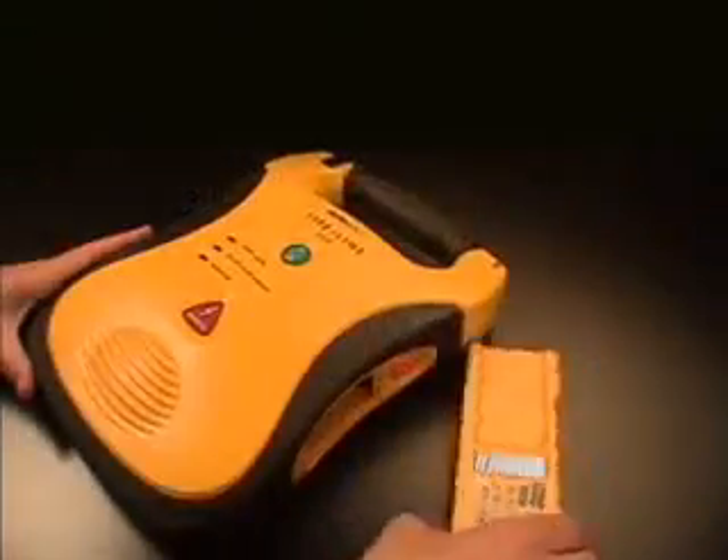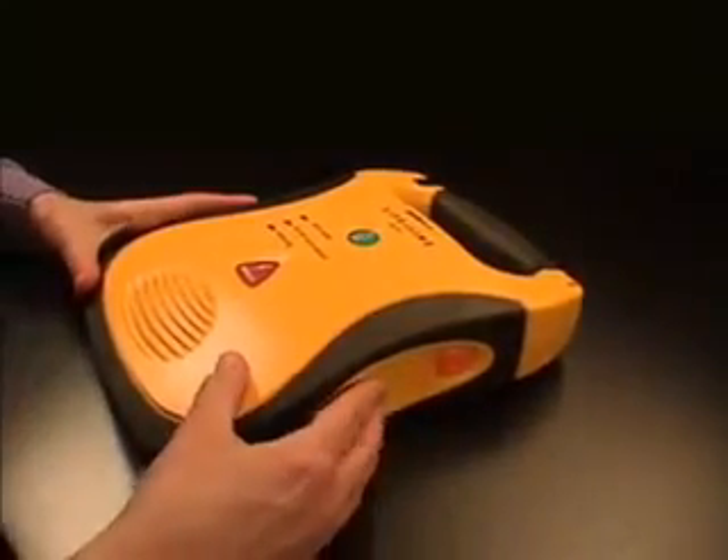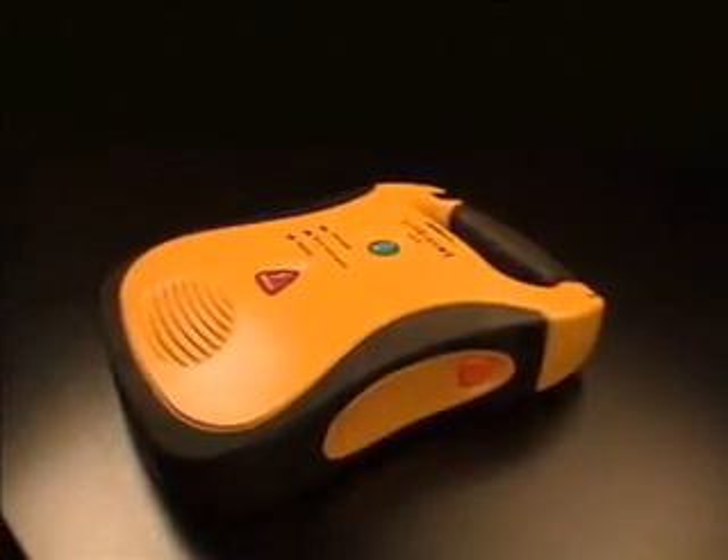If you have a spare battery pack, check its install-by date, which is printed on the label. The battery pack should be installed into an AED before that date. After the battery pack is installed in a unit, the AED will monitor the condition of the battery and inform you when the pack should be replaced.